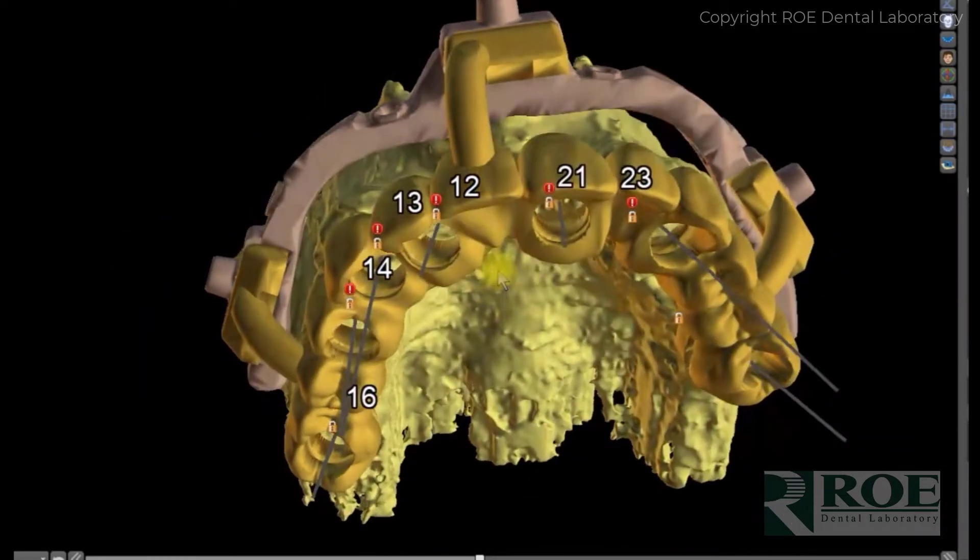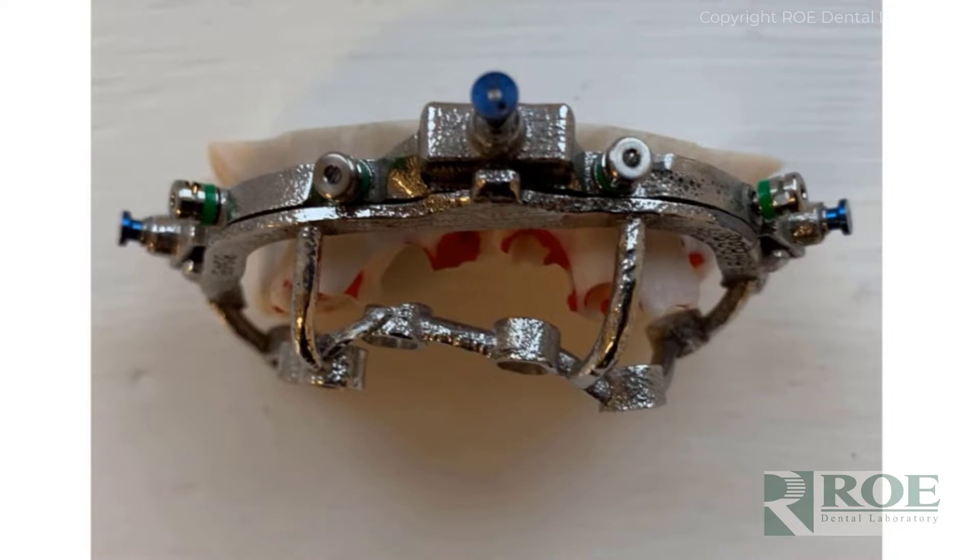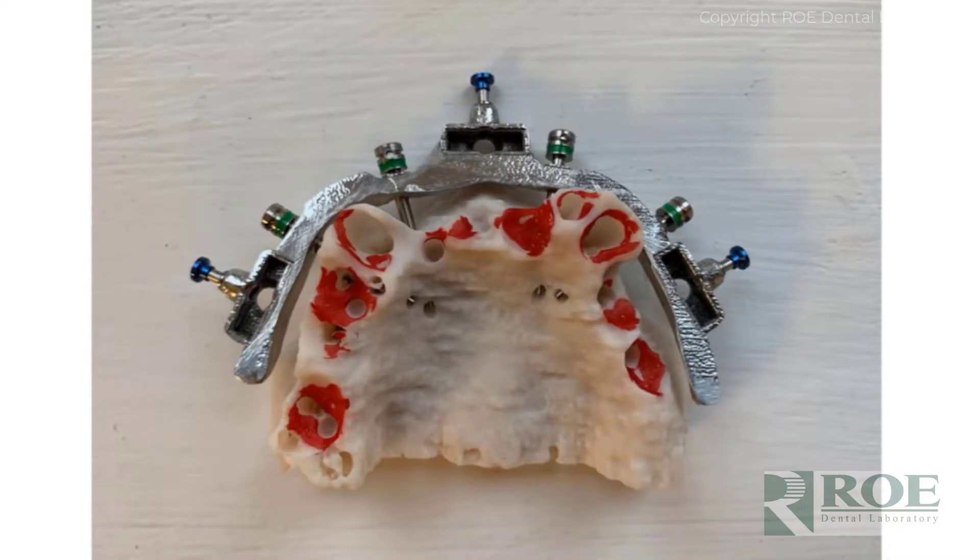When the case is printed and prepared for surgery, one of the things we have to do is place the prosthetic on the model. The goal is to adjust the sockets until the prosthetic is accepted — until it meets the pontic area and the socketed area — and to not reduce the prosthetic very much, because you don't want it to be thin. This is all calculated: how much bone should be reduced in these sockets. We remark with a red Sharpie at the laboratory, and the doctor will simply mimic that during surgery.